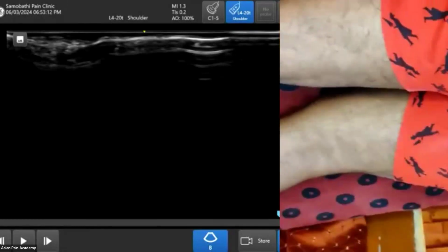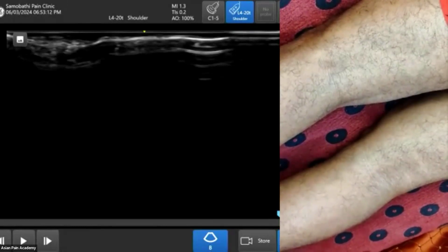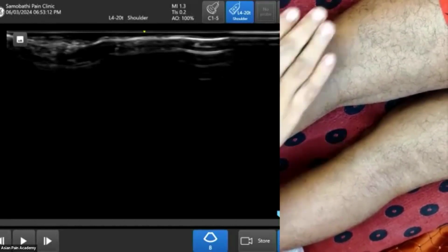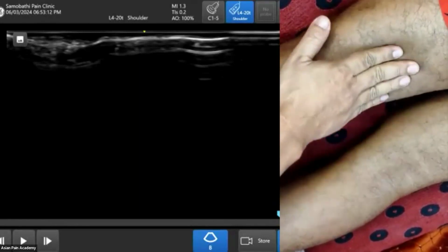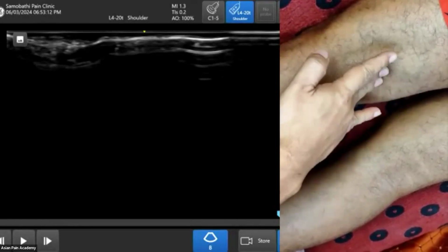So as I told you, there is one trick, and that is simply to go searching for the biceps femoris margin. This side is lateral, this side is medial. There is a triangular area like this that doesn't have any tissue, it is loose areolar tissue.